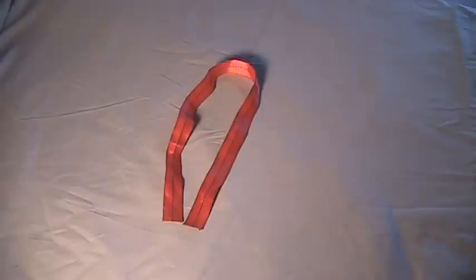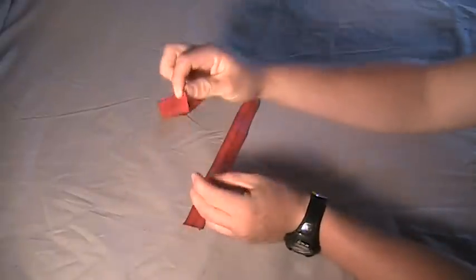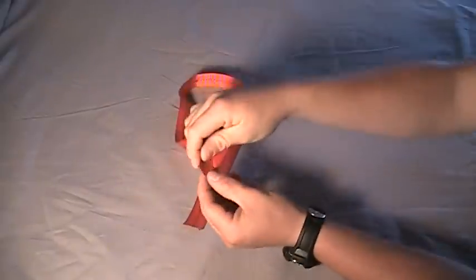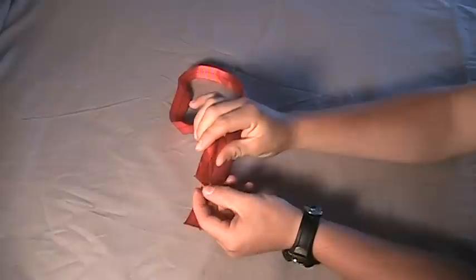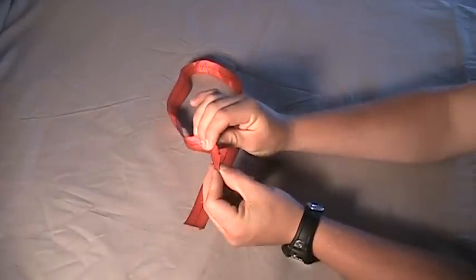Today I'd like to show you how you can make a temporary door wedge so that you can perform the exercises used on the RPM system. Start with a strap three quarters of an inch wide and two feet long. You can get wider strap, just be careful that it's not too thick as it can damage the door when inserting it.